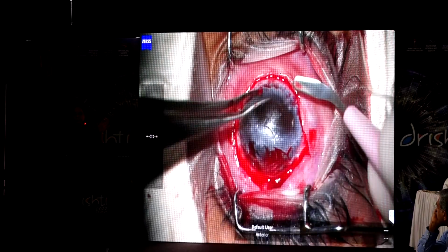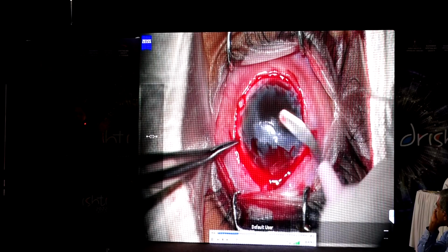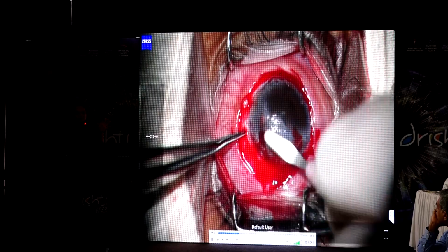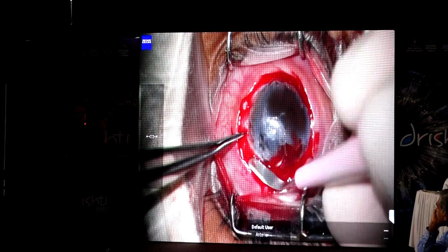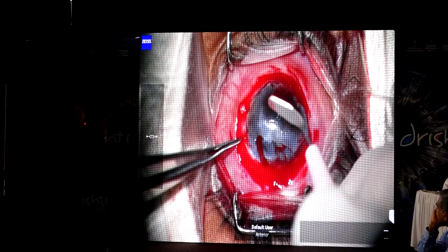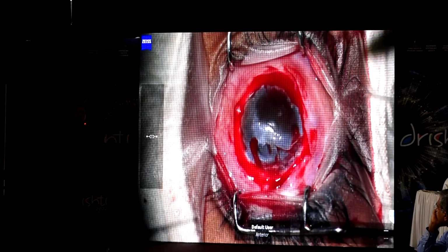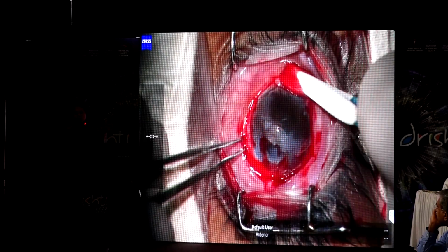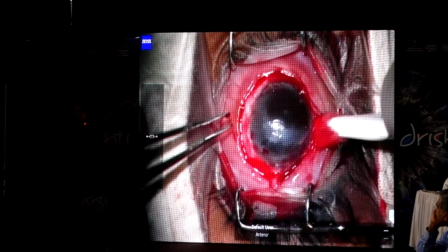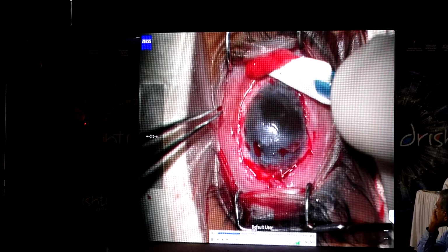So you can see I've just applied these cotton wicks soaked with adrenaline. And then what I tend to do is make a horizontal snip here and a horizontal snip here. That will divide your conjunctival cul-de-sac into a superior and an inferior half and will allow both to fall back, and then you can close the remaining surface with just amniotic membrane here. So that gives you an increased depth of fornix formation and gives you optimal preservation of the conjunctival tissue which is already present on the ocular surface for these patients.